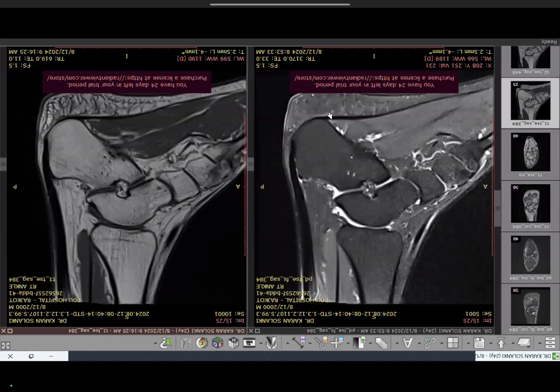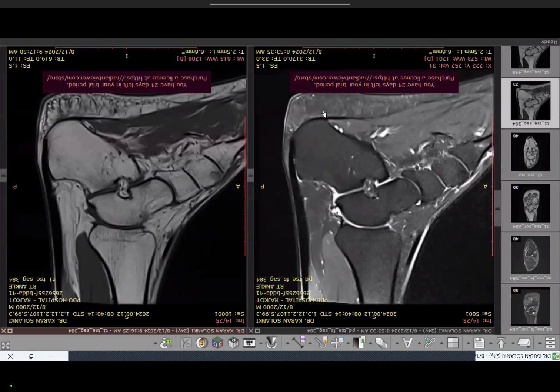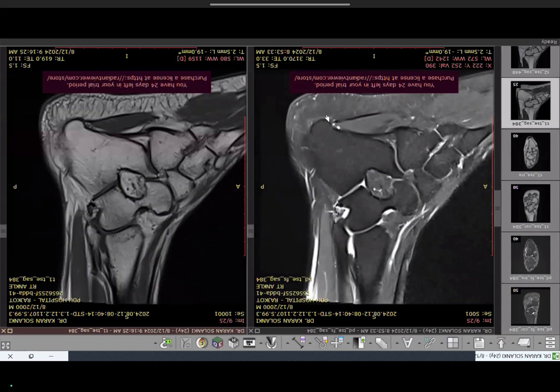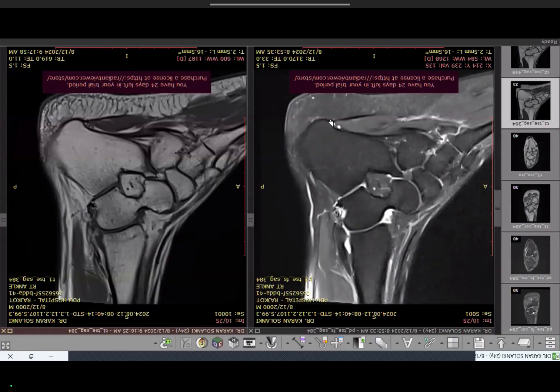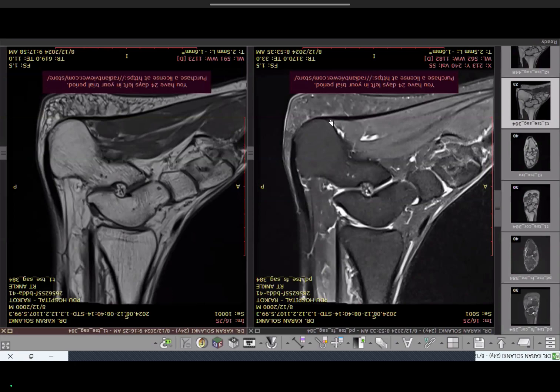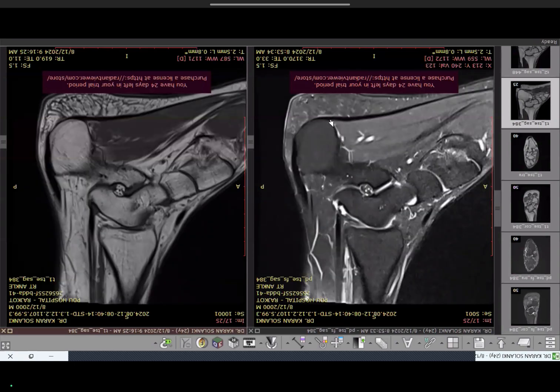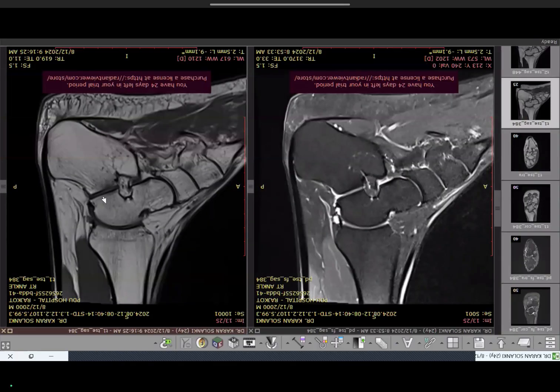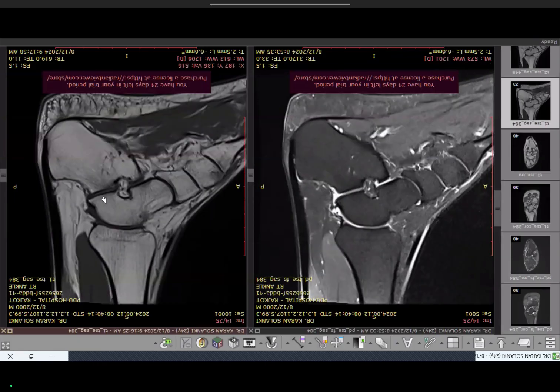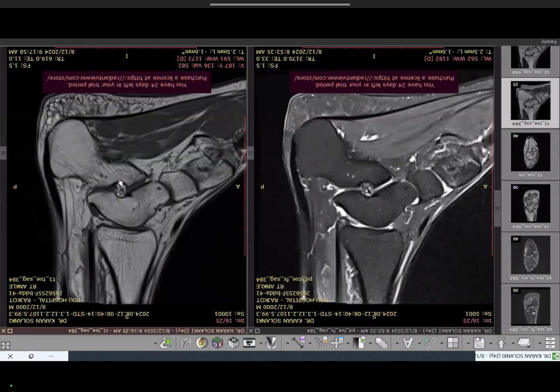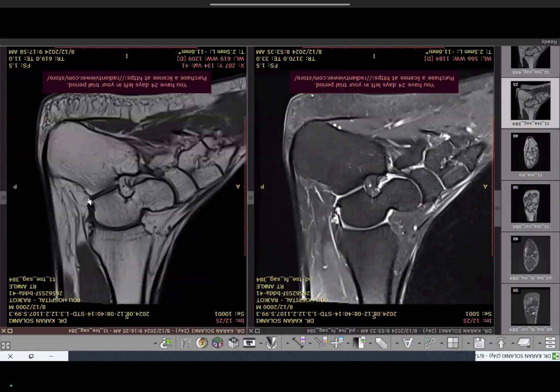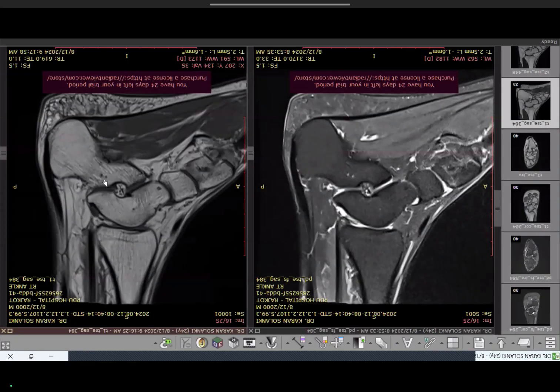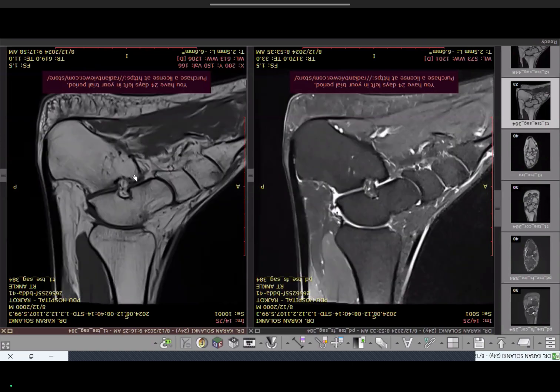Also look at the plantar fascia — its attachments at the medial and lateral calcaneal tuberosities. Any edema, large calcaneal spur, or abnormal signal here points to plantar fasciitis. The talocalcaneal articulation: talus articulates with calcaneus at three facets. The largest is the posterior talocalcaneal facet — fibrous coalitions are commonly seen here. Then there is the middle facet at the sustentaculum tali level.